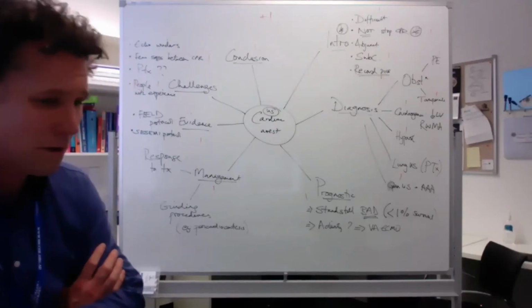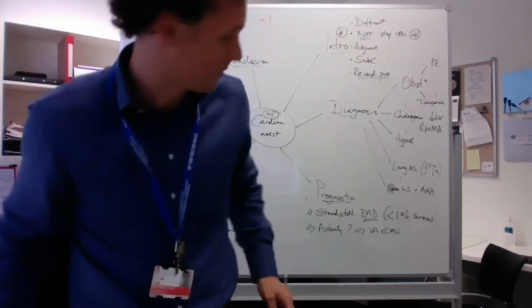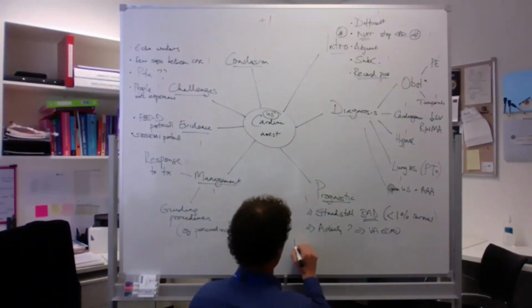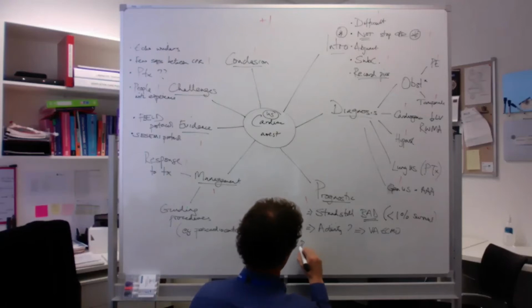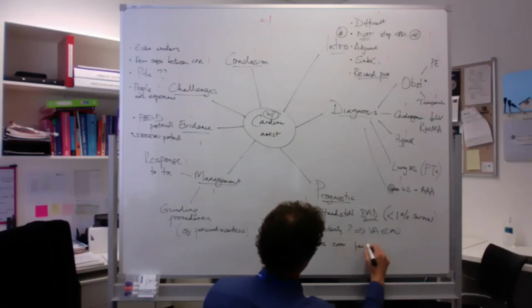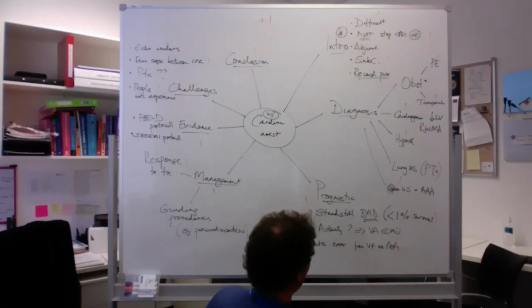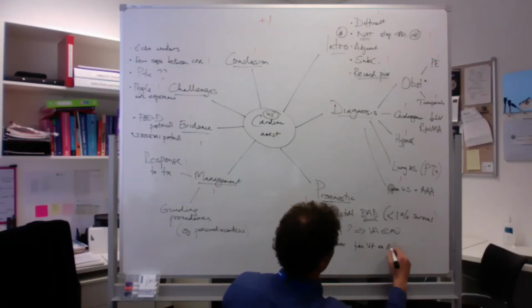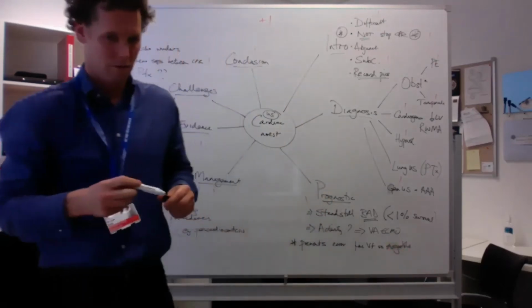What a great comment. And even more importantly, the error rate in the diagnosis of this concept called PEA, when there's no such thing as PEA. So it can separate out PEA into true PEA and pseudo PEA. And I think they're probably just as important as to diagnose obstructive causes of shock. And the evidence base isn't bad for that, actually.